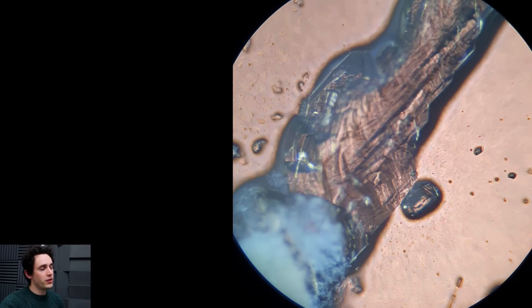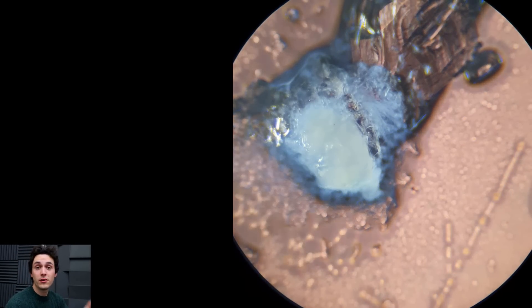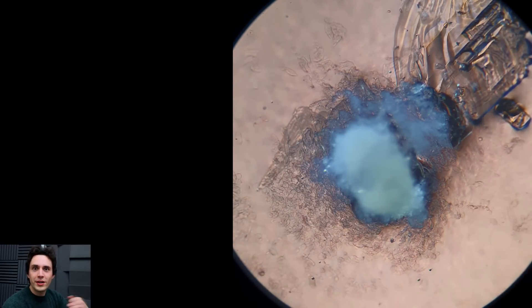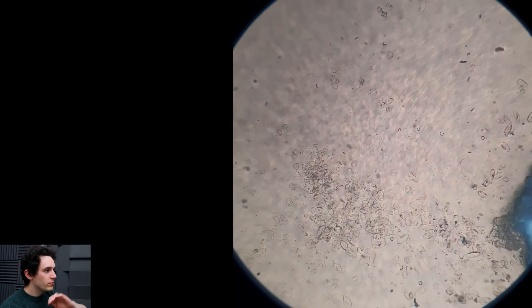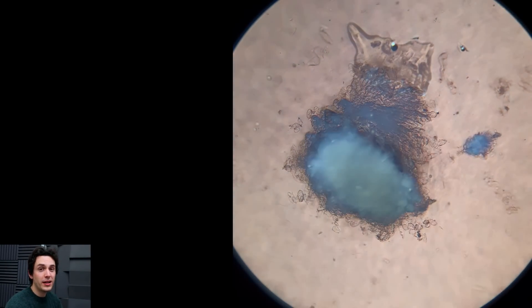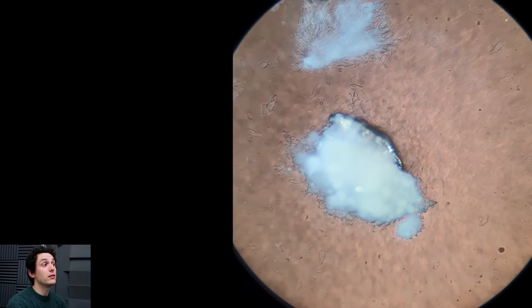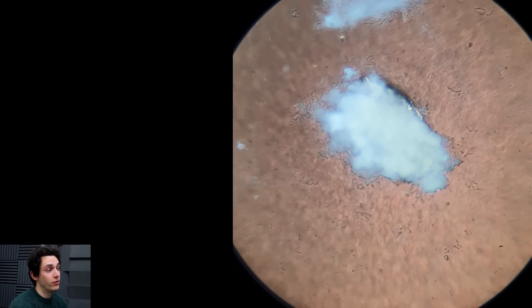What I think the surgeon is going to do is basically drill everything flat. The inner two-thirds of the ear canal are thin skin on bone, but it shouldn't be trenchy — it should be relatively smooth. So he's going to drill everything away, smooth it out, and then potentially lay some fascia over it, which is muscle lining. I'm not entirely sure what he's going to do, but if I can watch that operation I will, and I'll let you know what goes on.